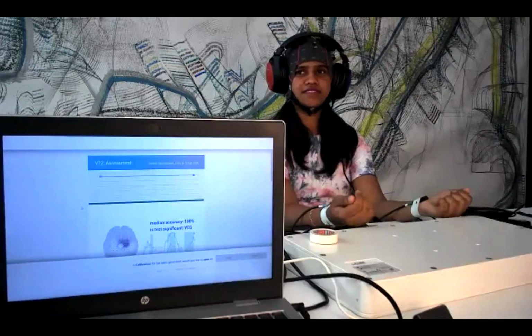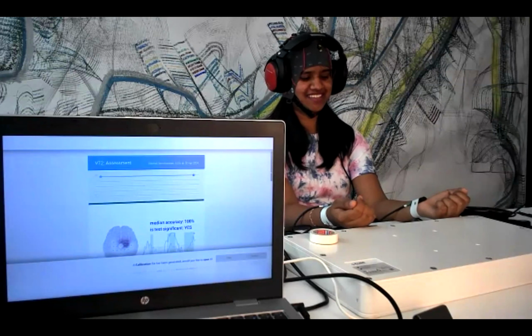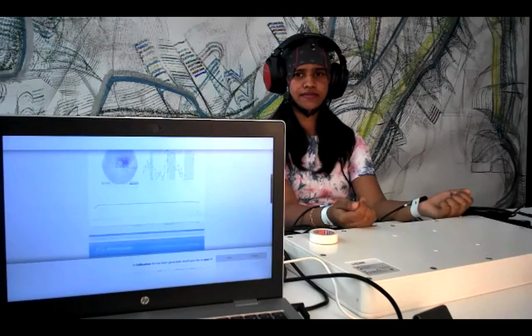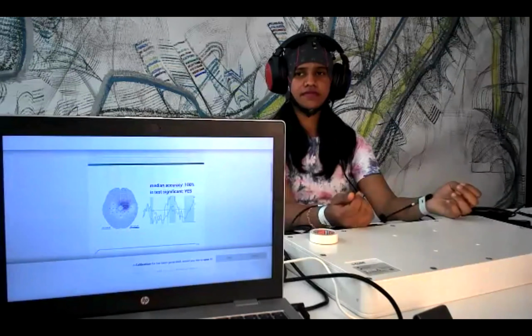Okay, perfect. We got 100% accuracy. Yeah, that's perfect. So we can also see the very beautiful evoked potentials here. You can see here, the significance also marks exactly around 300 milliseconds. That's a perfect P300.